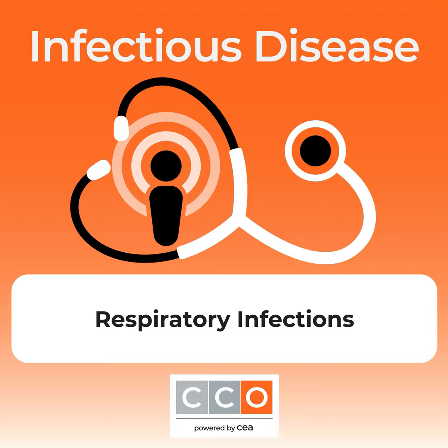And for example, this is the BioFire Spotfire system. And so this is a true point of care test for upper respiratory tract infections. And the Spotfire system can detect many of the different viruses that cause upper respiratory tract infections. And there's a different panel for viruses and bacteria that can cause sore throat. But it's very exciting that some of these syndromic panels are now moving to point of care. There are many laboratory-based upper respiratory tract infection syndromic panels, but essentially most of them will identify the common causes of upper respiratory tract infections. There are a plethora of these tests. They all work slightly differently, but pretty incredible that all these different assays can cover all these different pathogens with a single test.